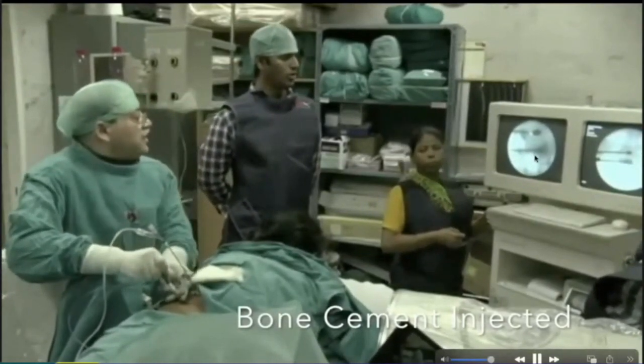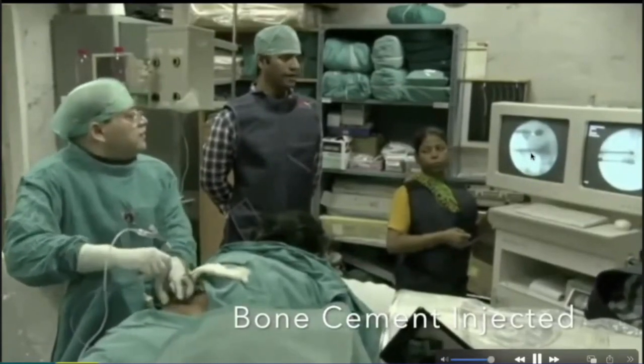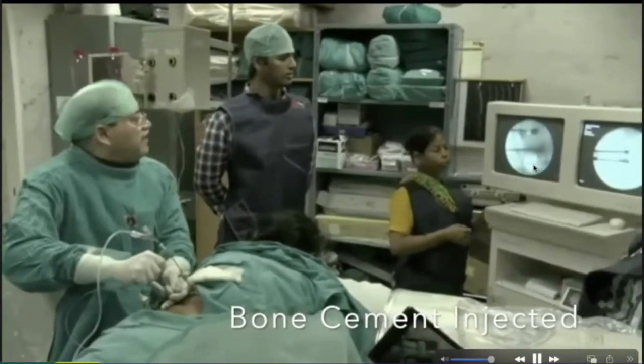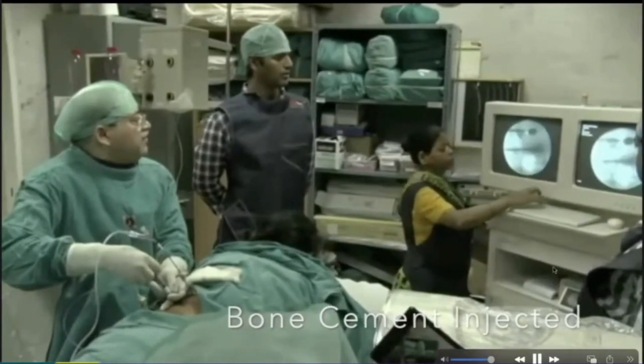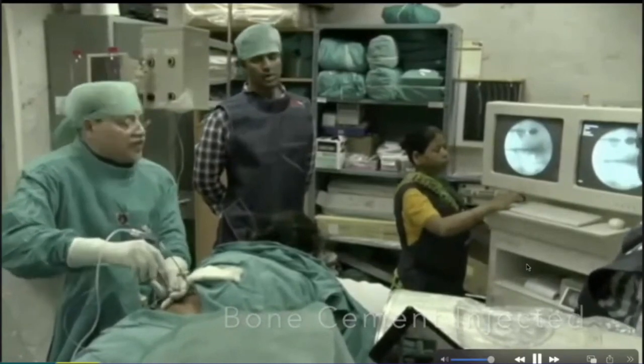Or by experience, you know it is leaking through clefts or coming into the basivertebral area. So by anatomy in AP and lateral and by your experience, you know where it is flowing, how it is flowing, what shape it is flowing. Is it really maintaining the vessel curvature, vessel structure shape, or is it getting blebby or something like this.